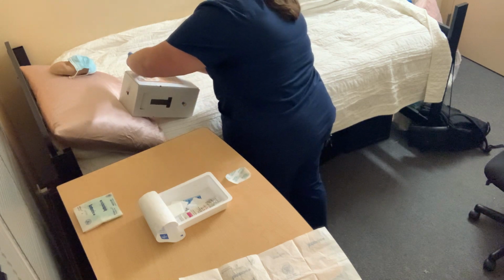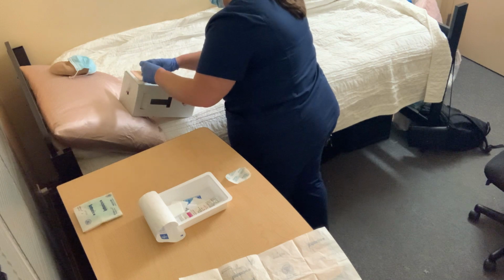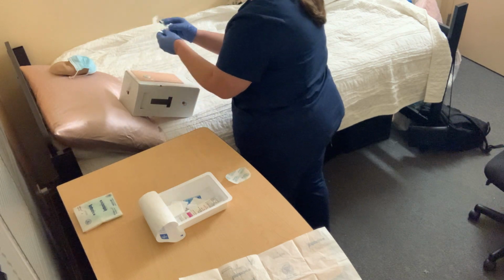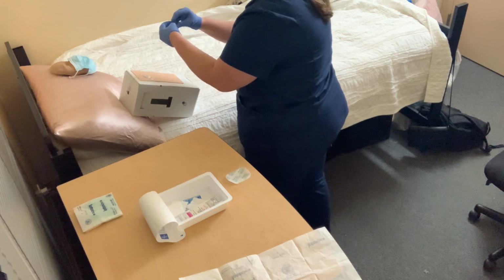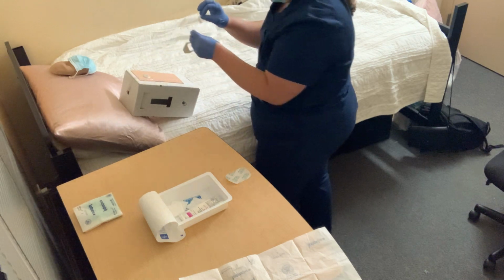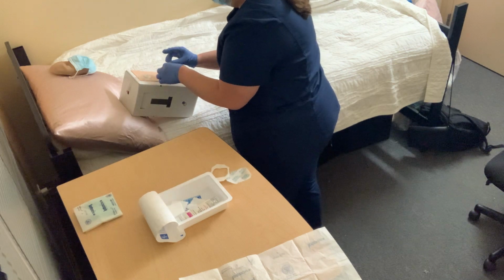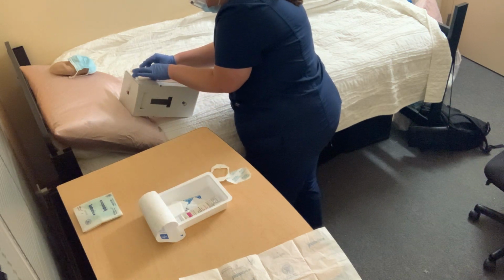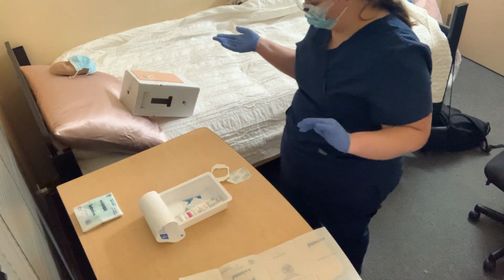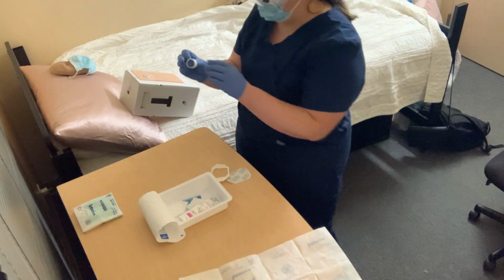So now I'm going to take off this white border around the tegaderm. And there's a sticker on here that I will write the date and the time I did the dressing change, as well as my initials. And I will place it near the central venous catheter insertion so the next nurse knows when the last dressing change was. Next, I'm going to grab my tape.